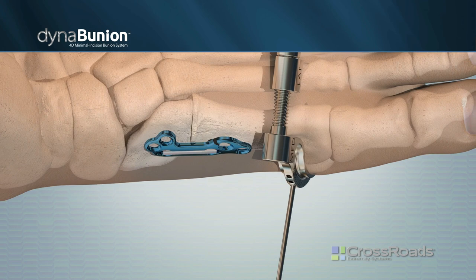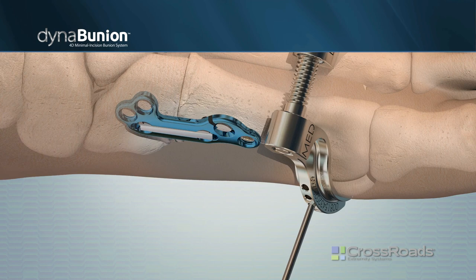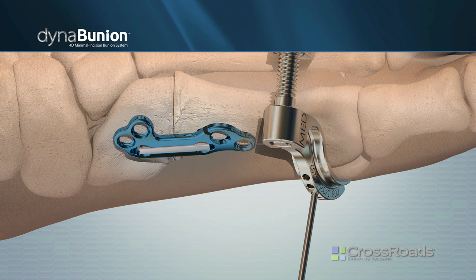The depth of the hole can be read by examining the line on the reamer within the window of the drill guide. Additionally, if desired, the provided depth gauge can be used. Attach the provided H10 self-retaining driver to the handle. Load the selected screw onto the driver and insert into the hole.